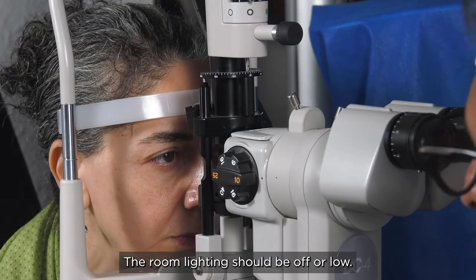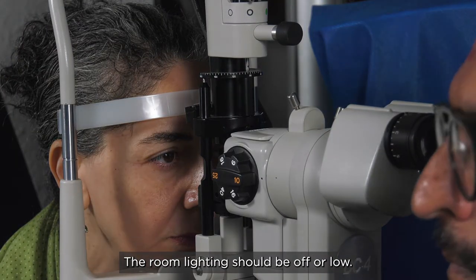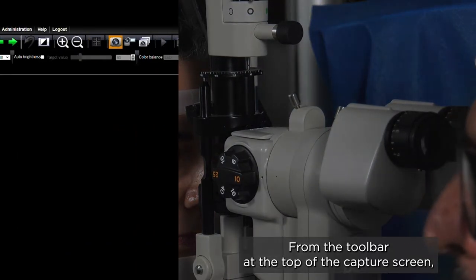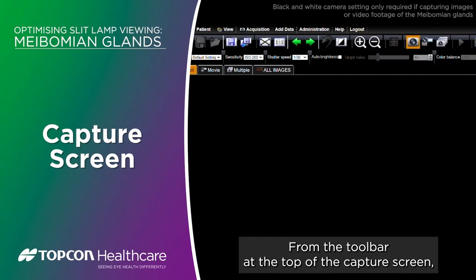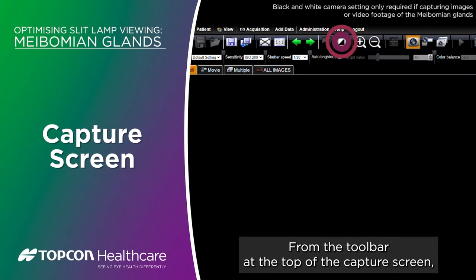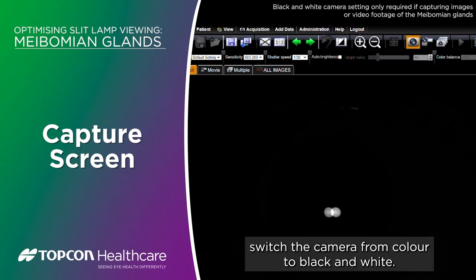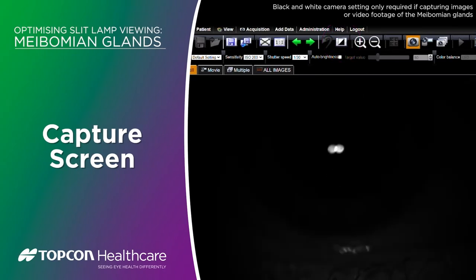The room lighting should be off or low. From the toolbar at the top of the capture screen, switch the camera from colour to black and white.